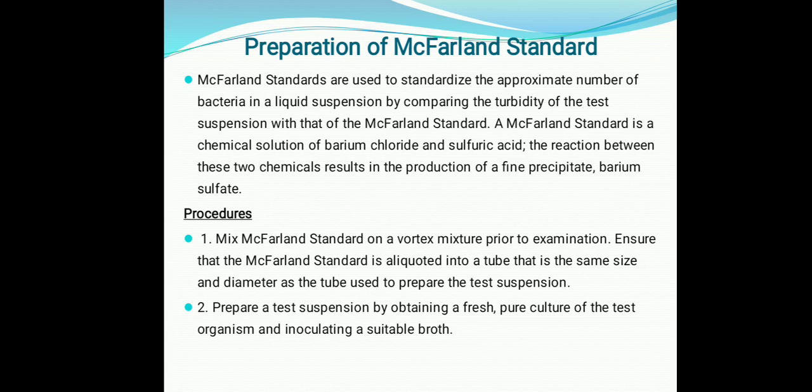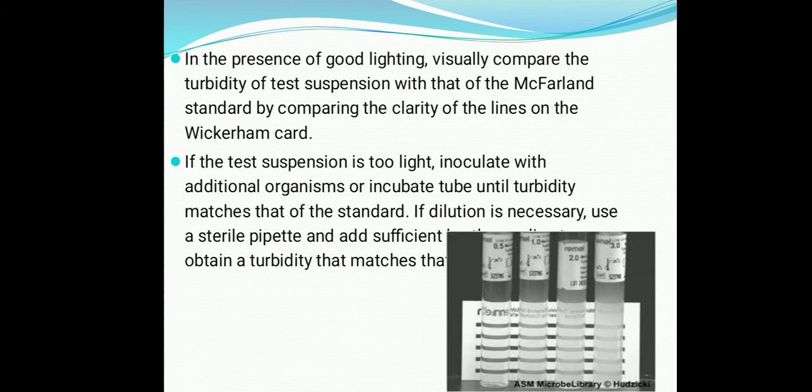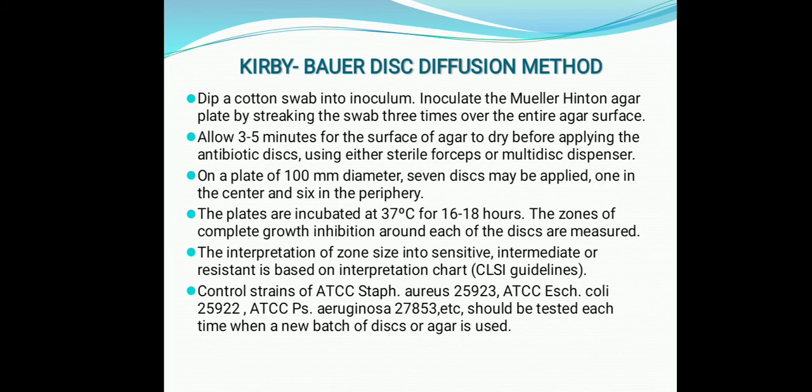So this McFarland standard is one of the materials needed for performing this Kirby-Bauer disc diffusion method. Other materials we will need are a Petri plate of MHA, or Mueller-Hinton agar, nutrient broth culture with swabs, a disc dispenser, a cartridge of discs, forceps and a Bunsen burner. Then we will need the zone interpretation chart.